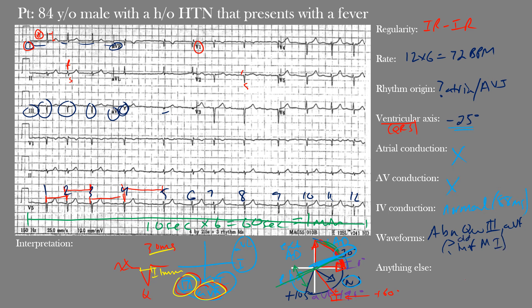Regarding anything else we may have missed: did you notice poor R wave progression in the precordial leads? When discussing R wave progression from V1 to V5, the R wave amplitude should increase progressively. Here we have only small R waves in V1 through V4, and by V5 the R wave should be much larger in most normal patients. This poor R wave progression may indicate an old myocardial infarction not previously reported.